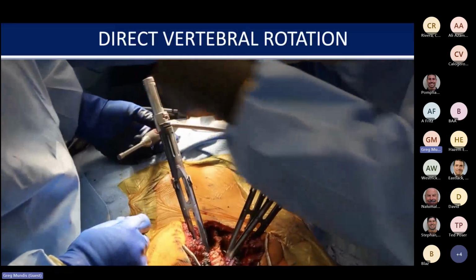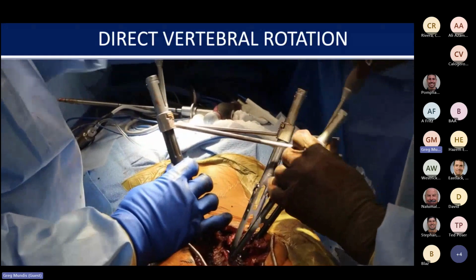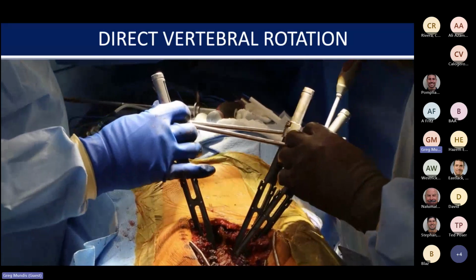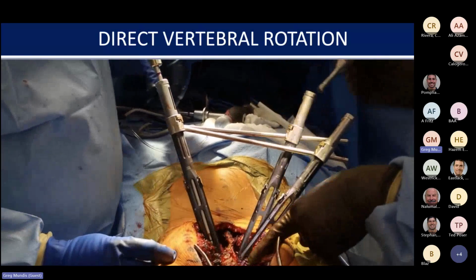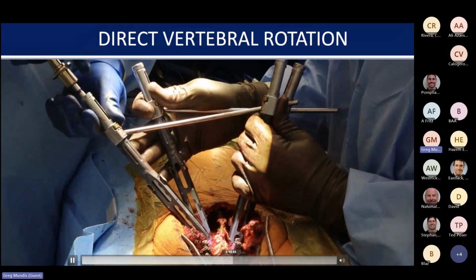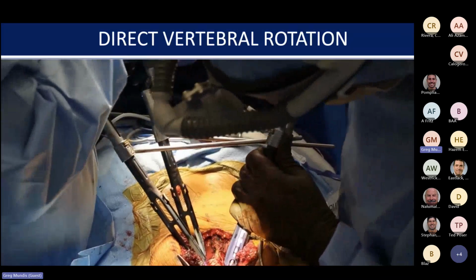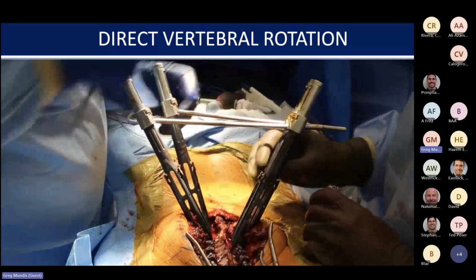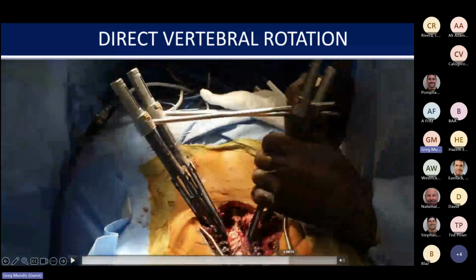And so we'll do the same process all over again, where you move up the spine, connect the next level up, and then rotate the next level relative to the first. We'll usually do this all the way up to the apex, or even consider going into apex +1. Just to show you again here, you can see how we go past point a little bit, tighten the set screw. I'll do my side, and then when I release, you'll see that we've just about got these towers pretty even. And then just keep going up the spine until you hit the apex.